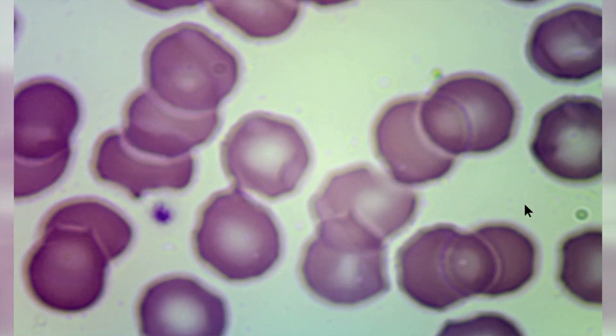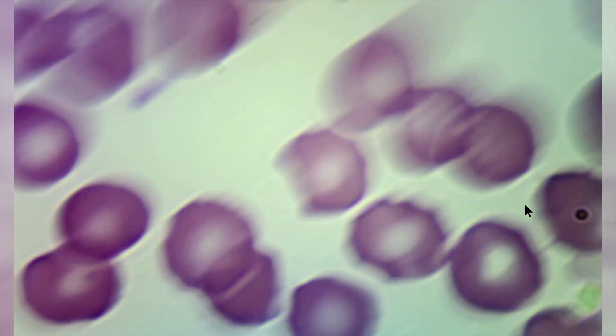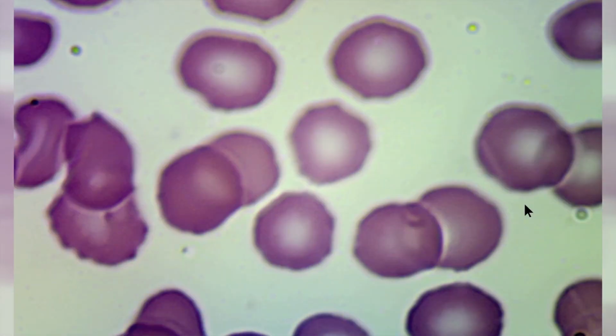The other cell that I am trying to find for you is the basophil. Basophils are not as often seen in a blood smear as other white blood cells. Usually 1 to 2% of the cells are going to be basophils. Basophils are often seen in allergic reactions.